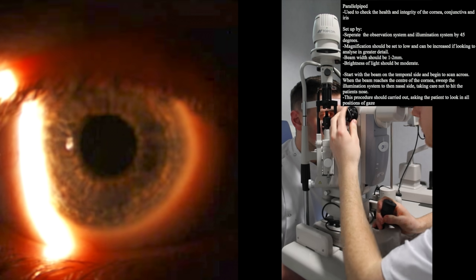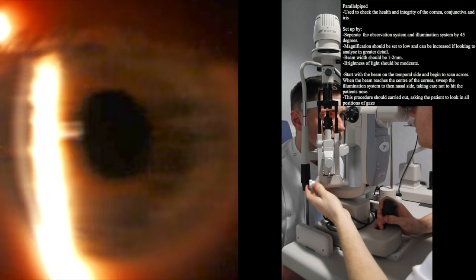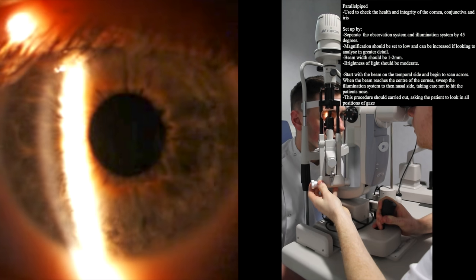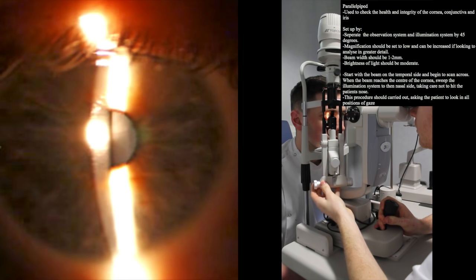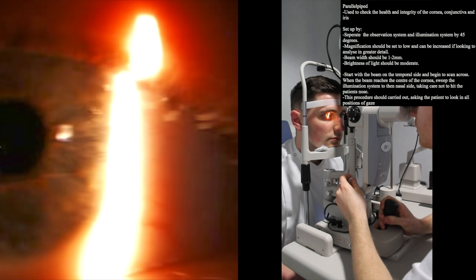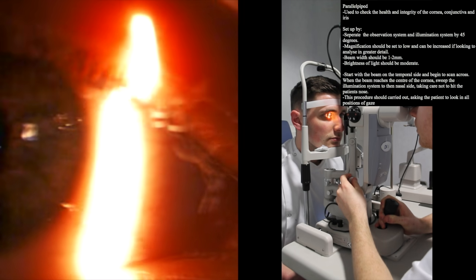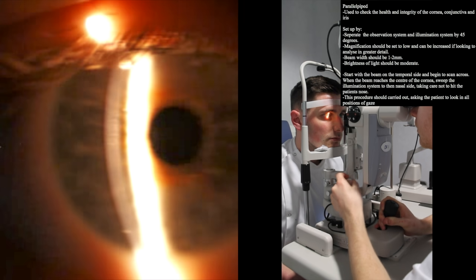Start with a low magnification and increase it if needing to gain a more detailed look. Then scan across the eye until it reaches the centre. You will then have to sweep the illumination system across to the nasal side, taking care you do not hit the patient's nose.